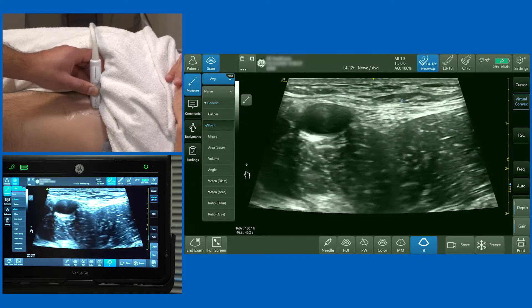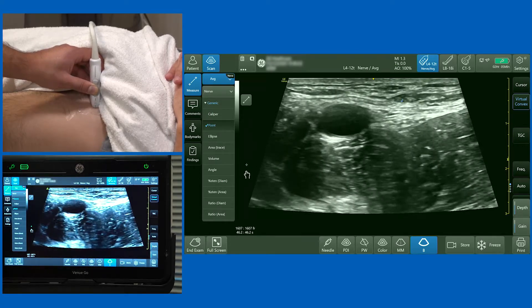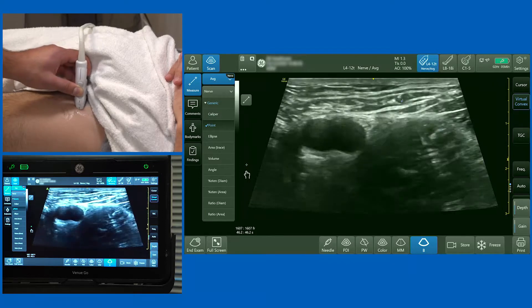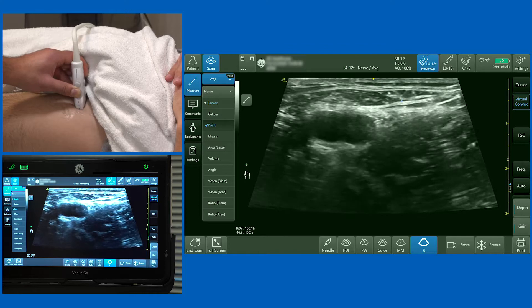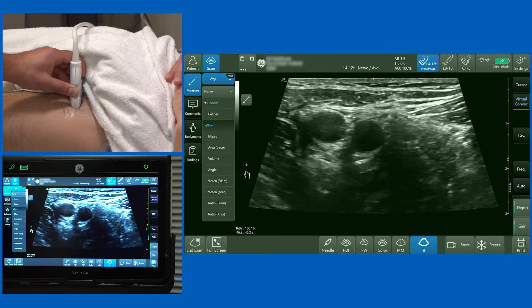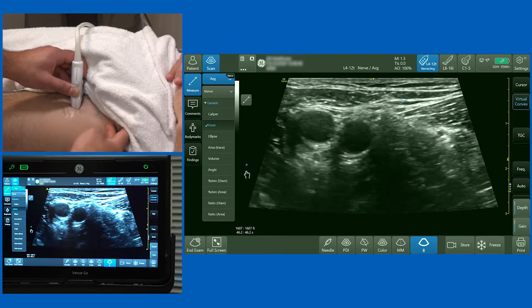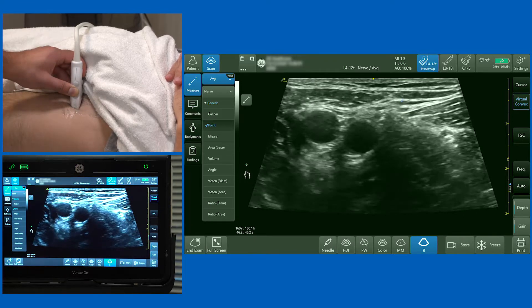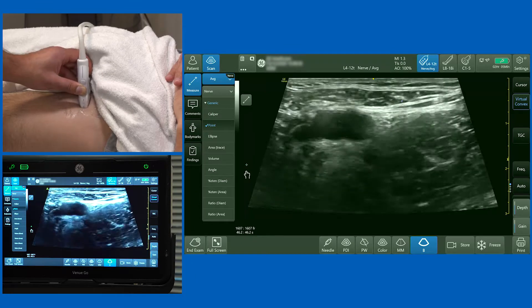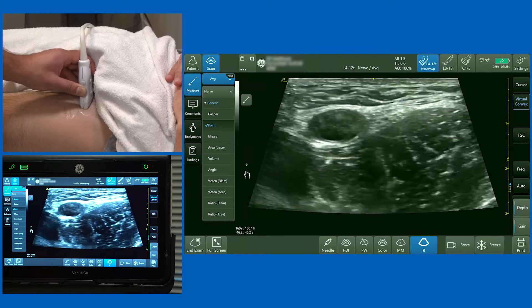One of the problems people often make when performing a femoral nerve block is scanning too distally. As we scan distally, you'll see the profunda femoris artery come off, giving two pulsatile structures on screen. If you're seeing two femoral arteries, you're scanning way too low — all I've done is move from just above to below the inguinal crease.